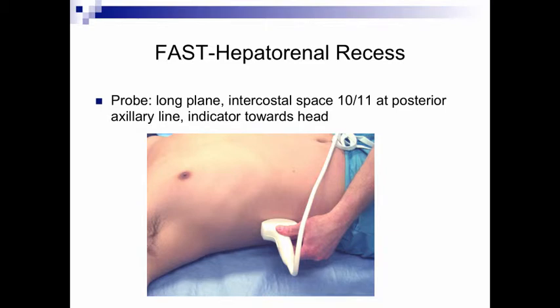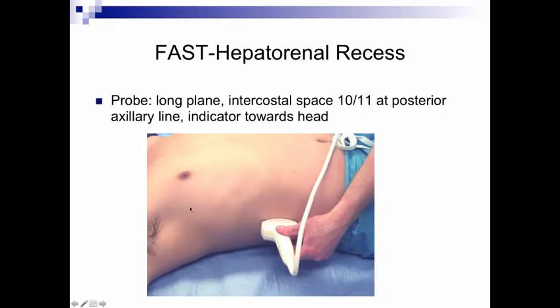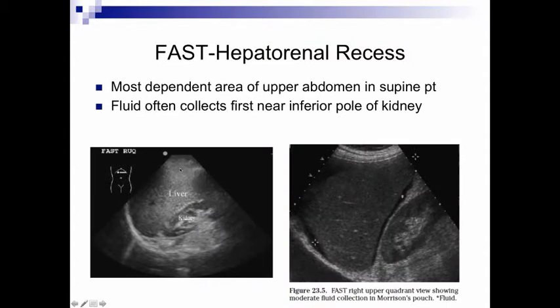And if you have positioned it accordingly, what you're looking for is an image like this with the liver and the classic liver echo texture, a bright diaphragmatic line, and then kidney outlined here with the fascial planes of the kidney closely abutting the liver. And this is a normal hepatorenal view.